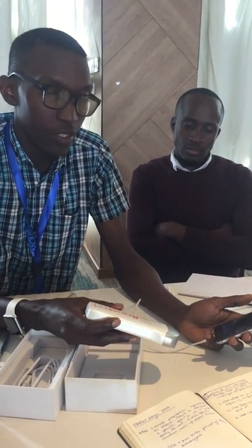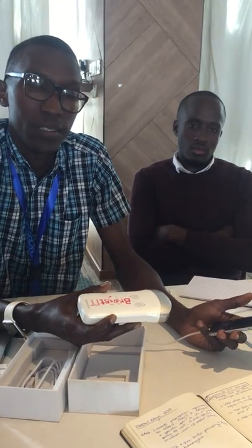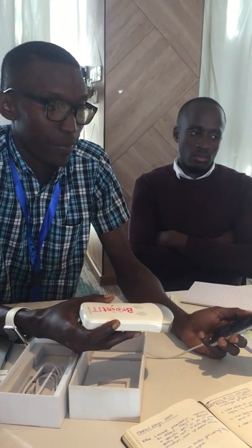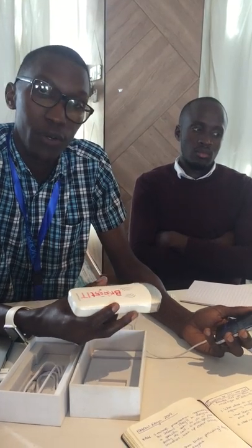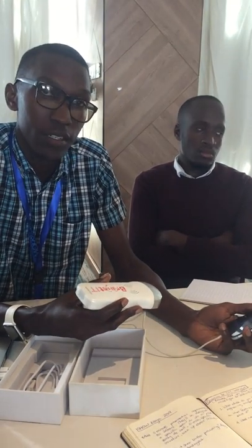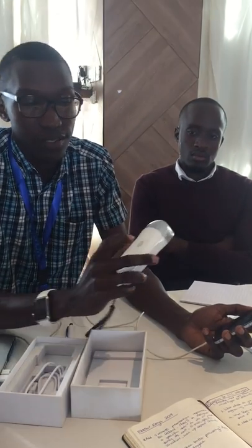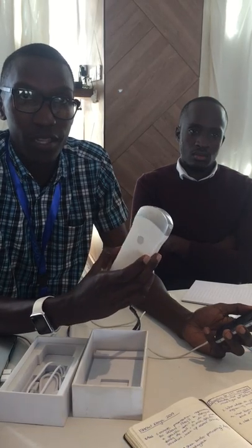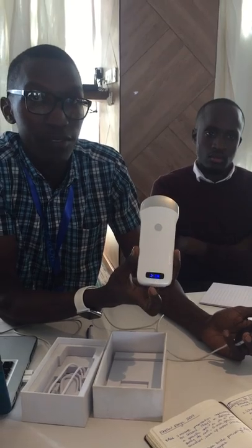We're at BreastIT and we're using an AI-powered portable device to carry on breast cancer screening. This is just going to show you how the whole probe works with the phone and how the whole technology works together. So this is a probe — handheld — this is the power button. Turn it on right there. It has an LED that will show you the battery life and the connectivity.